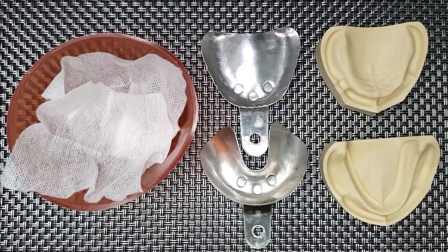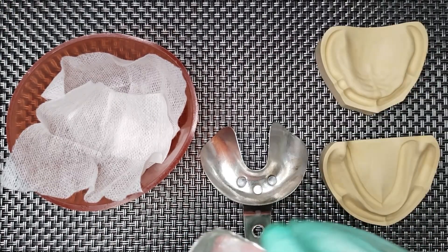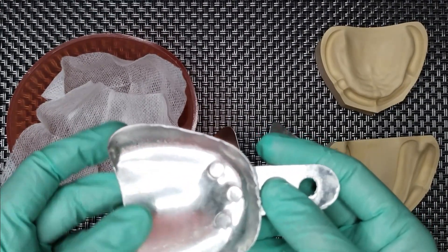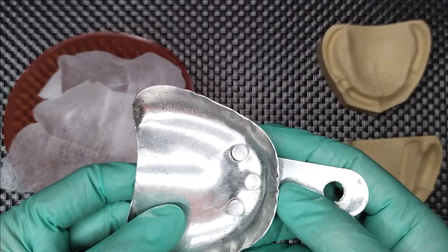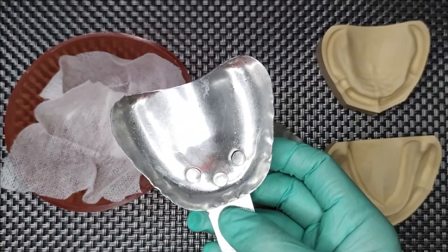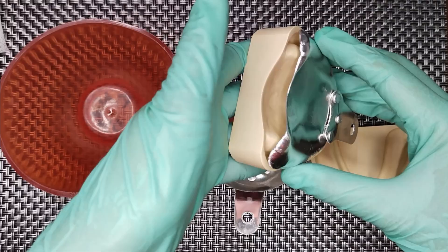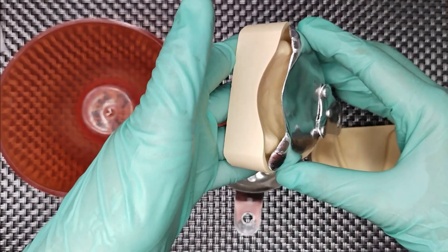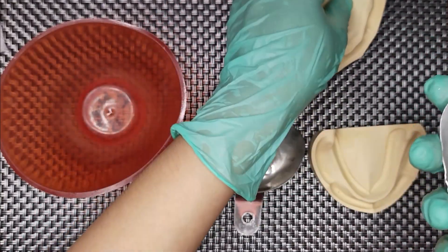Before starting the impression procedure, you need to prepare your trays. In our experiment, we will use this aluminum stock tray that you can shape, cut, or extend to the appropriate size. As you can see, the tray is larger than the model, so in this case we can shape the aluminum tray.